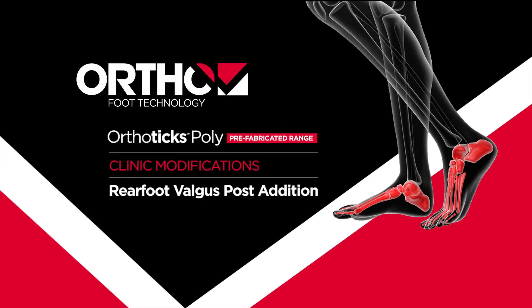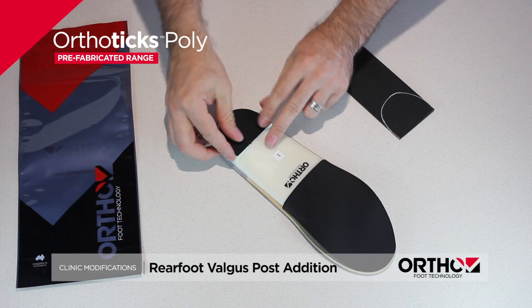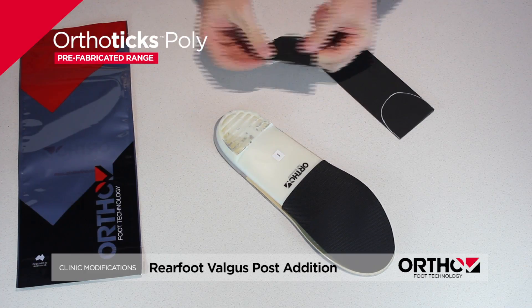Orthotics poly prefabricated range. Clinical modifications: rear foot valgus post addition. Customization of the orthotics poly by the addition of a rear foot valgus wedge, with application to increase rear foot control. Instructions follow.